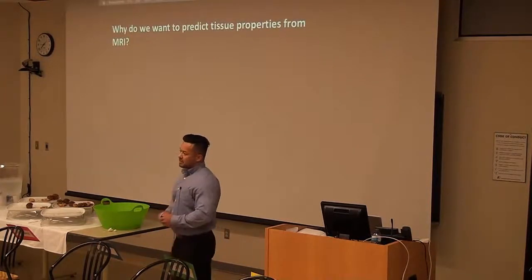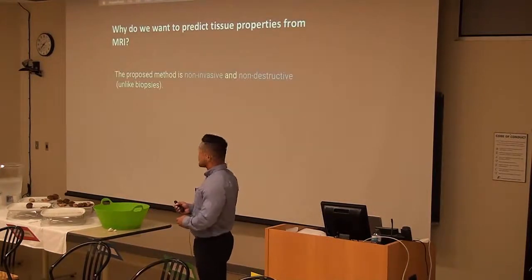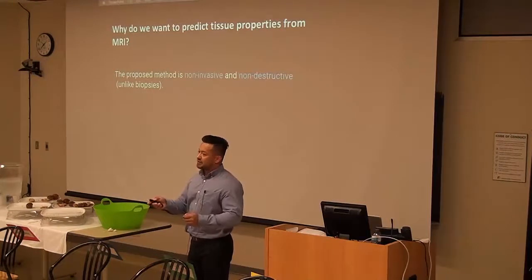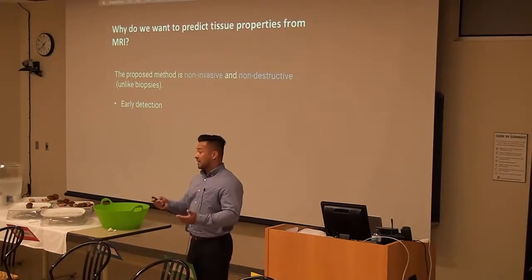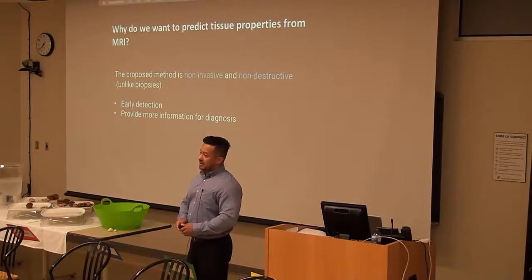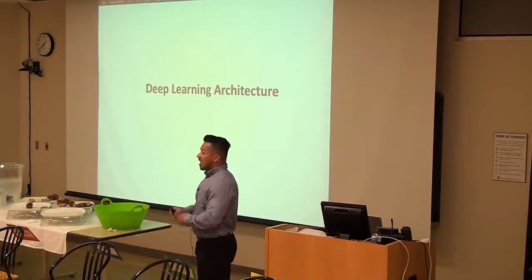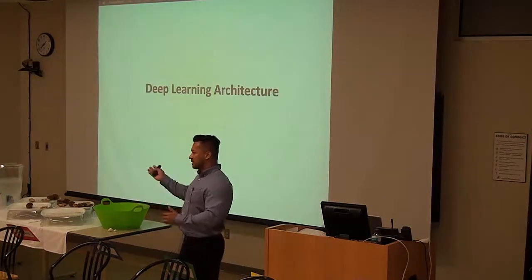So let's think about it for a little. Why do we want to do this? Because if we do this, then this method is not invasive, so we don't have to have the surgery. We can have early detection of any pathology just by scanning the patient with the MRI. And we can provide information for diagnosis and also for the effectiveness of the treatment or the progression of the disease. So now I'm going to show you my proof of concept, how I approach this problem.